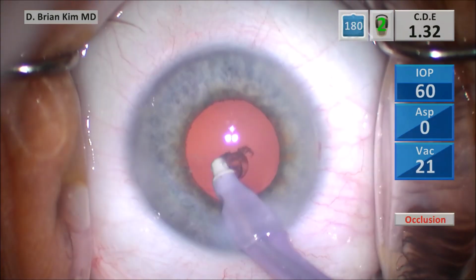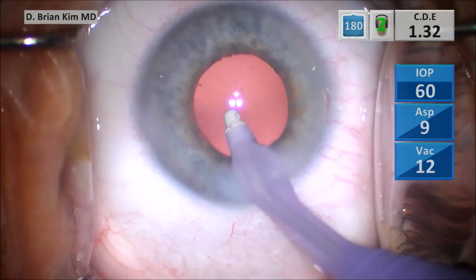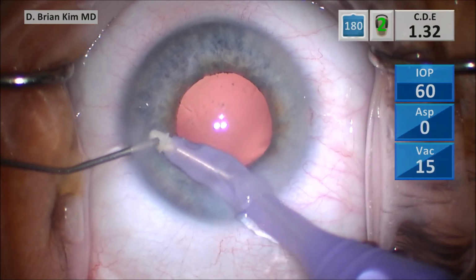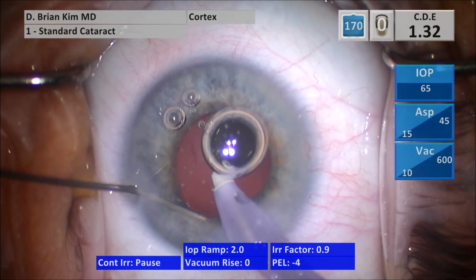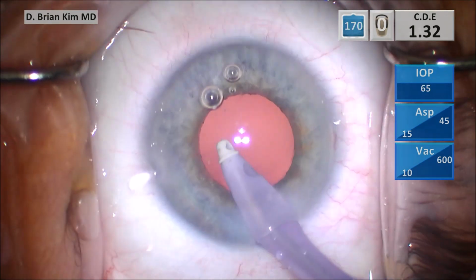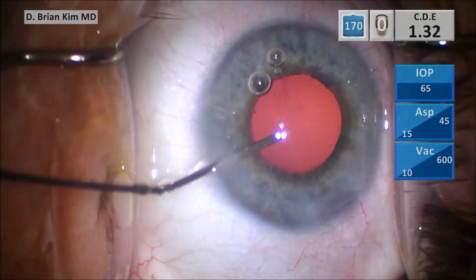You saw that it grabbed a big chunk of subincisional cortical material. There's a piece right at the incision, so I crushed it. I'm using the BSS cannula to flush the subincisional capsular fornix. It's fairly clean, I don't see anything there. And then I'm pushing some cohesive viscoelastic to inflate the capsular bag.